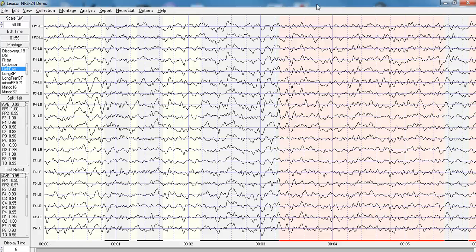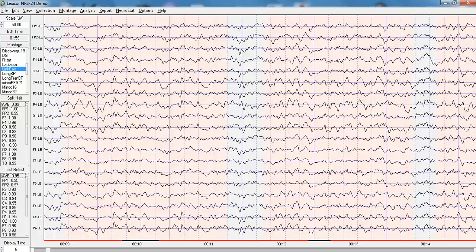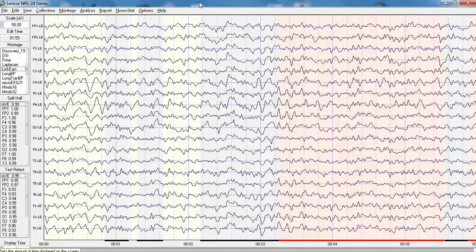Age 55, eyes closed. And you can see the right central has a much larger amplitude of theta here than the left central, right parietal larger than the left parietal, and the right occipital larger than the left. This is clinically deviant from normal, and there's many examples of that throughout this record.